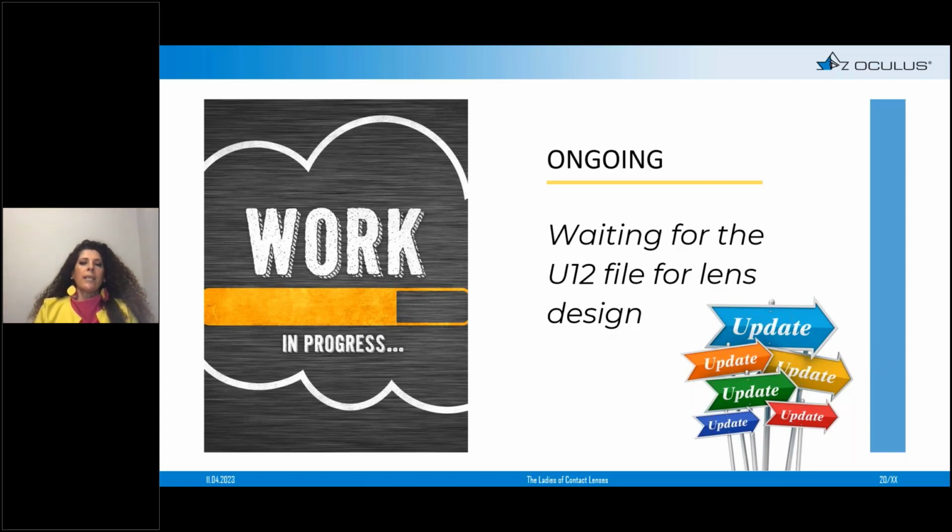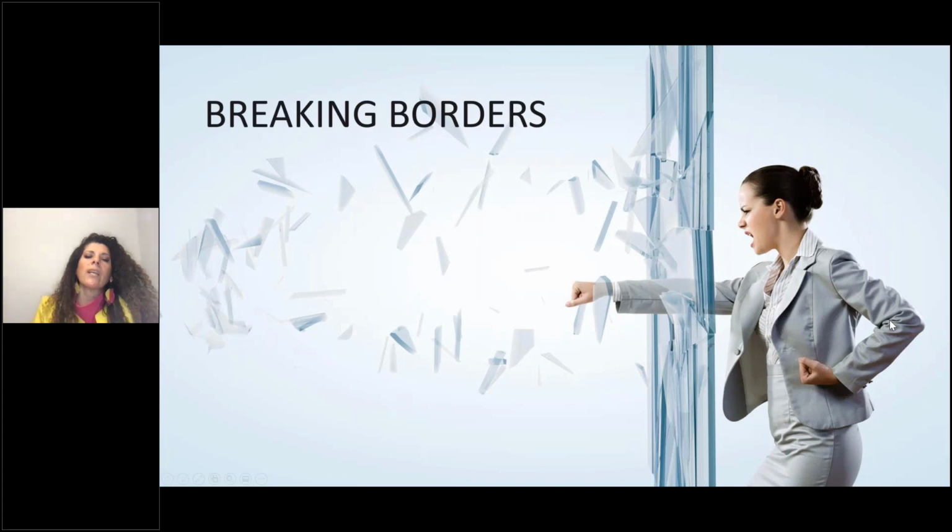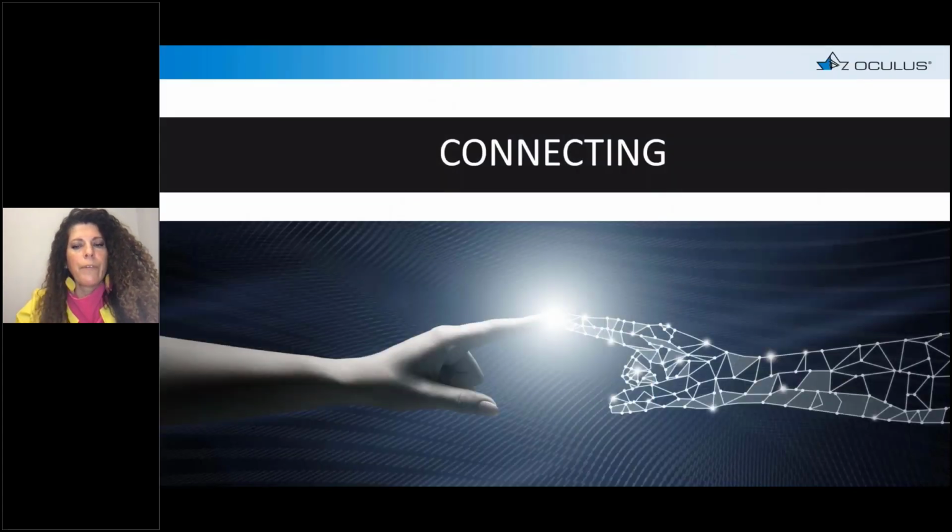So these cases demonstrate how technology has the potential to revolutionize the fitting process between peers, enabling optometrists to provide assistance and experience across different countries and different continents. Next, please. And the use of remote fitting technology allows extending your arms and hands to be helpful in another country, in another continent. And this is helping connect optometrists around the world.